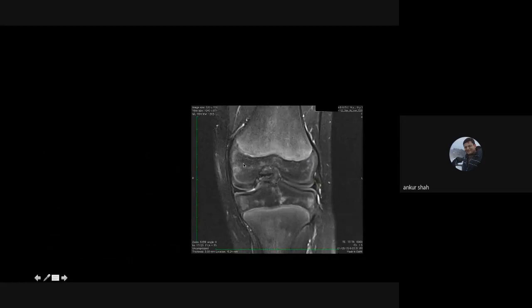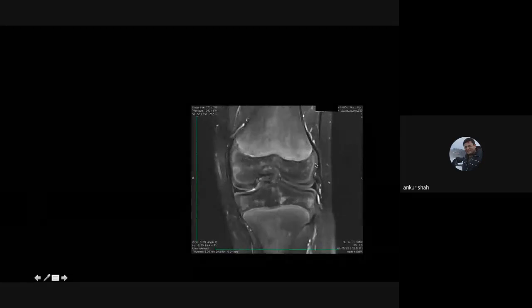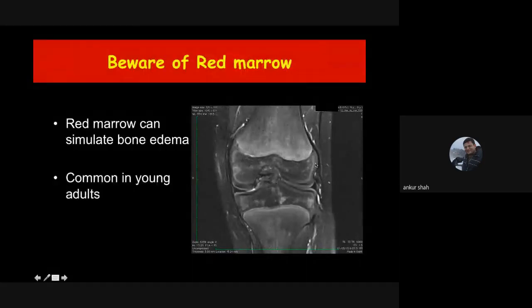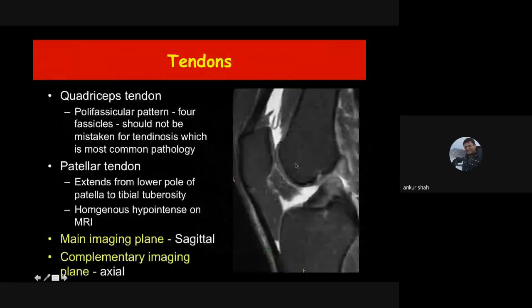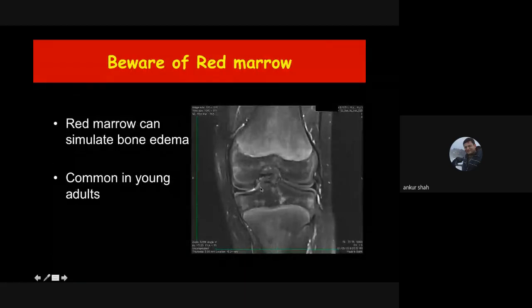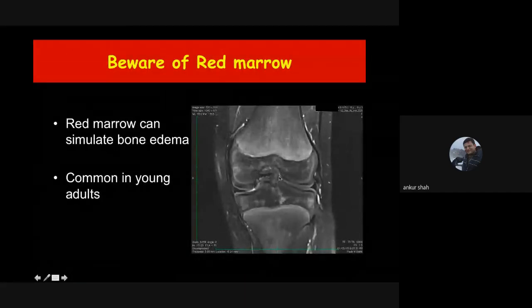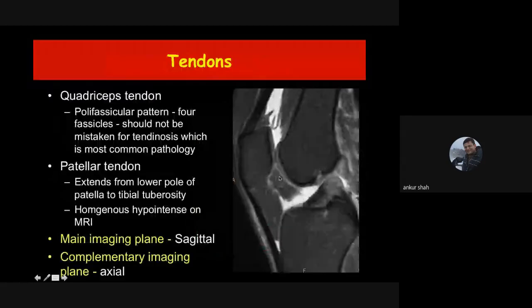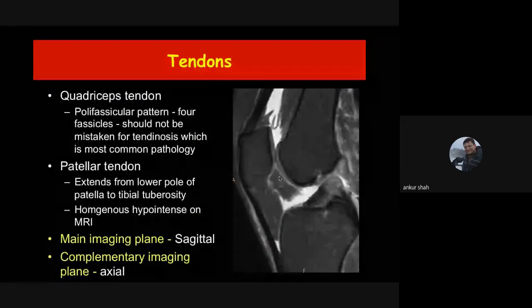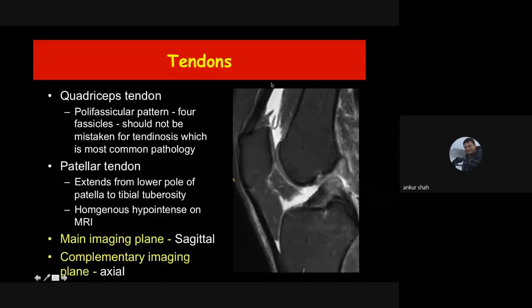When you see a heterogeneous appearance in a young child's bone marrow without any history of injury, this is not bone contusion or bone marrow abnormality — it is just the normal heterogeneous appearance because of the presence of red marrow, very common in young individuals. Do not mistake this as an abnormality or a marrow infiltrative disorder.